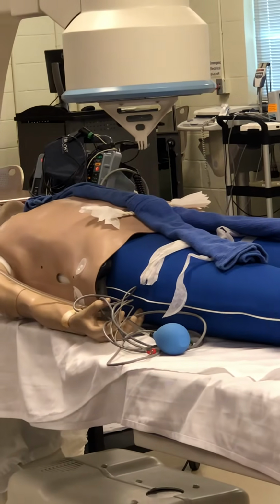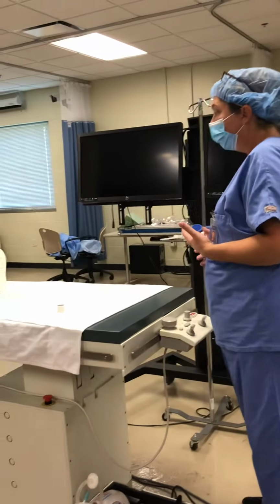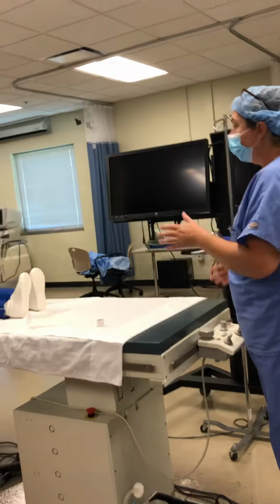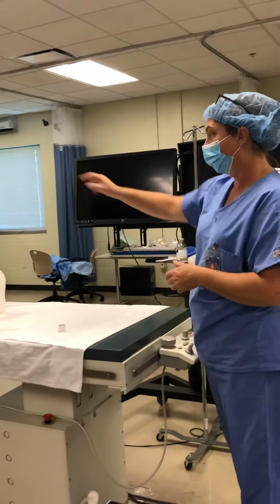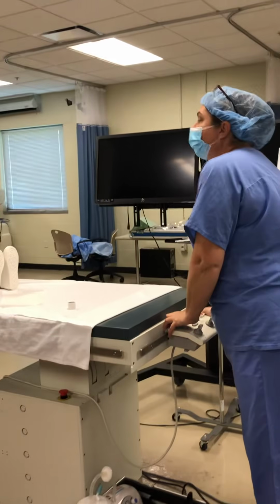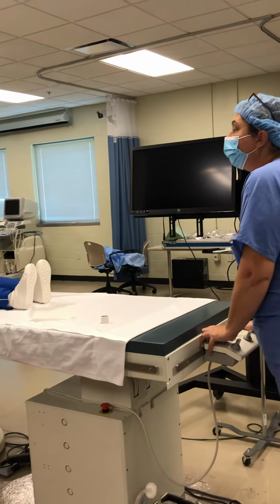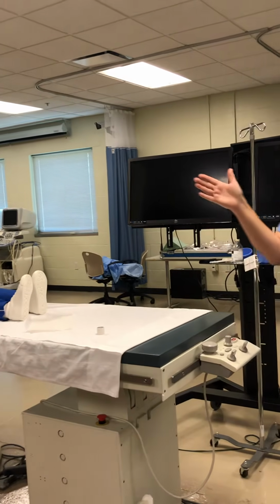Now, when it's time to do selective, and we're going to do the left renal, all we're going to do is come down a little bit, but we are going to move the patient over a little.